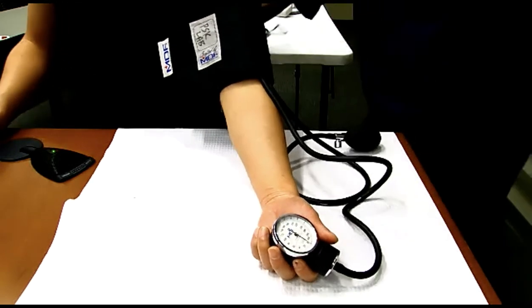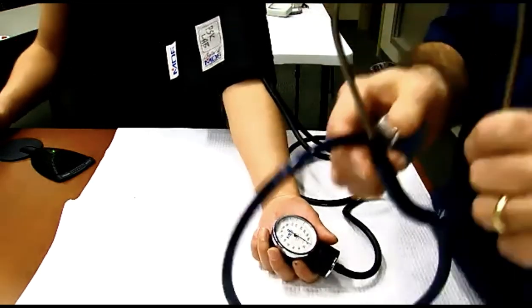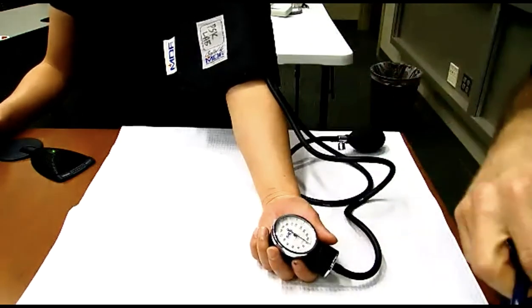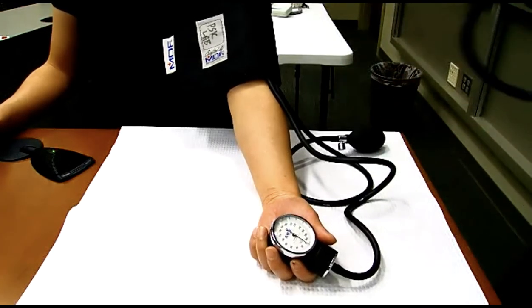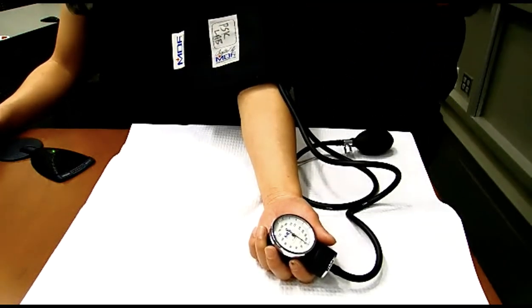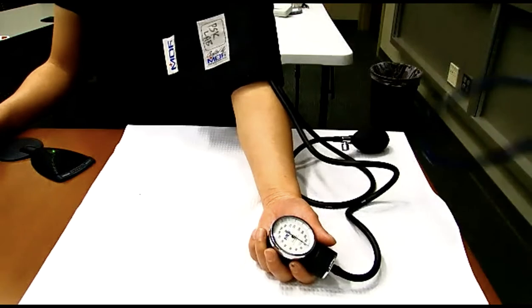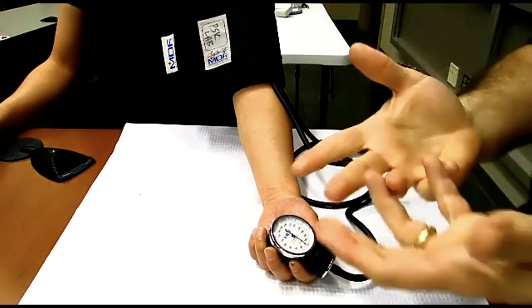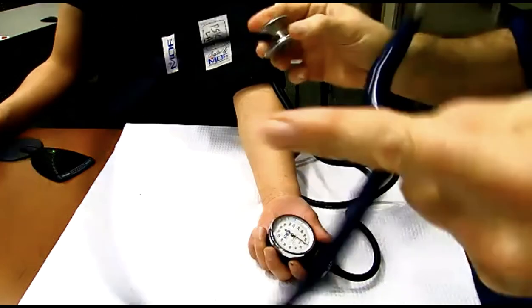So here's the problem with some of you. You put this in your ear right away, and then it's dangling down and it gets in your way. So what is the coolest way that Judy would have her stethoscope on? Right there. Well, you can't see anything. See, this video thing doesn't work. All right. Sorry, guys. Have this around your neck like this. That way, when you're ready to use it, you can pull it off your neck and use it.